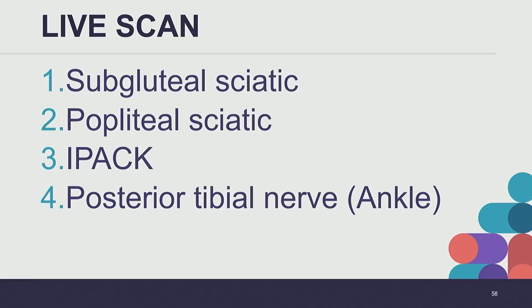Yeah, and then more reason to make sure. Remember the 3 centimeter marking that I showed you for the popliteal sciatic nerve. Same principle here with the IPAC. Start further away from your transducer so that your needle comes in a very flat trajectory, and that way you avoid having to come from a very surface level and potentially hit that peroneal nerve.